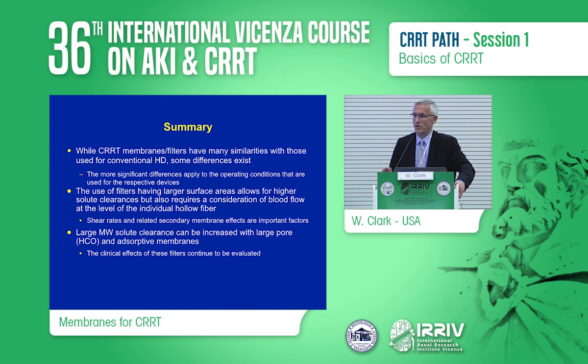As I mentioned, there's clearly been a trend over the past 10 years or so to use higher surface area filters, which really mandate higher blood flow rates and other therapeutic fluid rates to maximize filter function. And then finally, we continue to be very interested in the removal of larger molecular weight, especially inflammatory mediators. And these new approaches are shedding more light on how we might be successful with that.